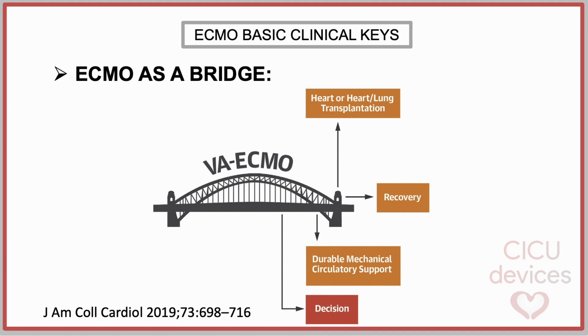ECMO is a temporary form of extracorporeal life support that can replace part or all of the function of the lungs, the heart, or both, while the underlying condition recovers. ECMO does not treat the underlying disease; rather, it provides a bridge that maintains oxygen delivery and systemic perfusion while the underlying condition is addressed. In clinical practice, VA-ECMO is used as a bridge to recovery, decision, transplantation, or longer-term support in selected patients.